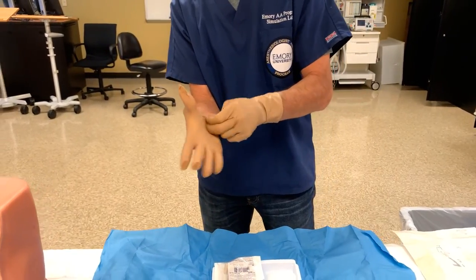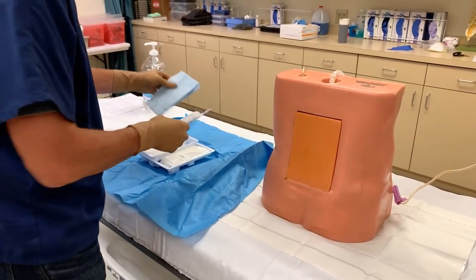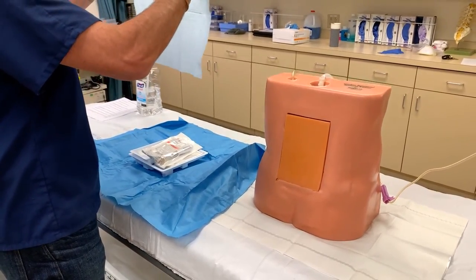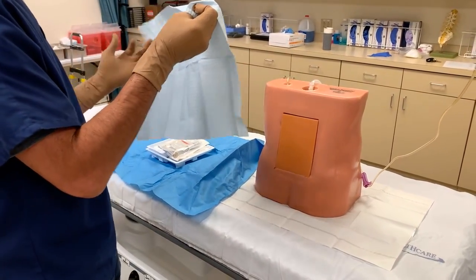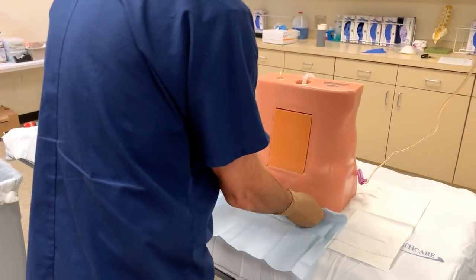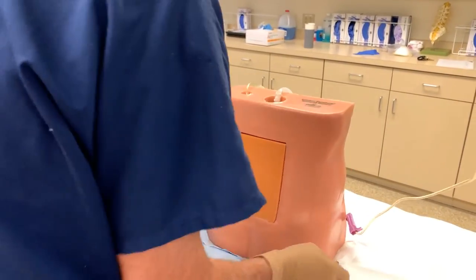We're ready to go ahead and prep. Here's our prep — we have a sterile towel that we'll often place underneath the patient to catch anything that might drip down. We'll fold it over to protect our sterile gloves. Lean forward, ma'am, if you would — there we go.